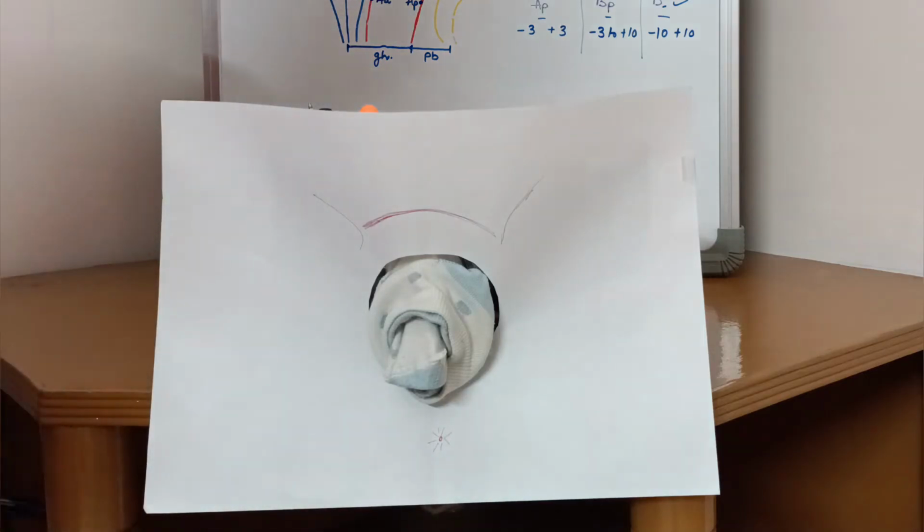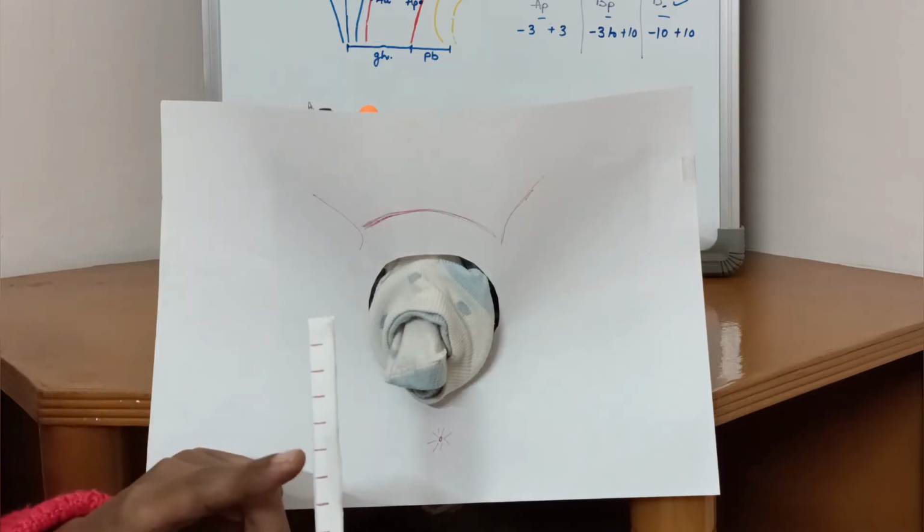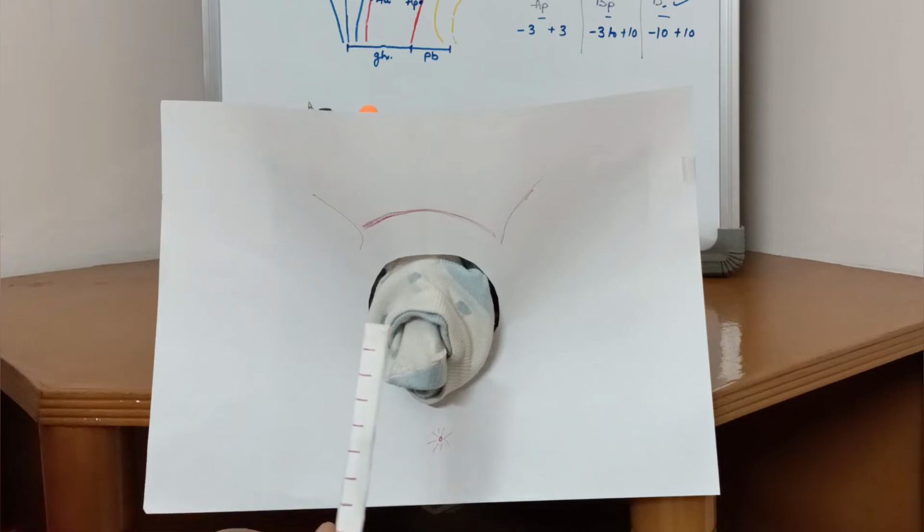Starting with the GH, first I'd like to tell you that you require a graduated scale like this. These have 1 centimeter markings, and you can have them on an iron spatula or a copper T rod.